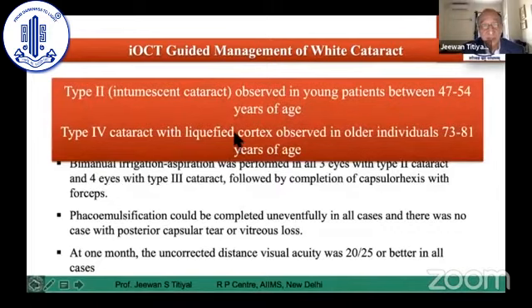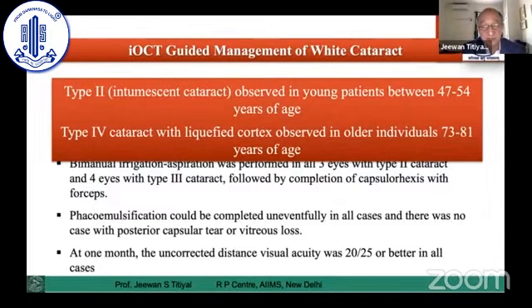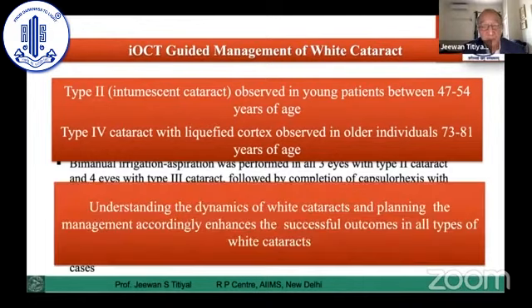So I can understand type 2, if you see those type of cases, you have a slightly higher chance of rhexis getting extension to the periphery unless you take appropriate measures during your initiation of capsular rhexis in these cases. Type 3, type 4, needle aspiration of cortex or exchange with viscoelastic or doing a small capsulotomy will help in these cases. So all white cataracts are not similar. You have to understand the clinical picture in the pre-op examination with slit lamp or anterior segment OCT. Intraop OCT does give you a lot of help.